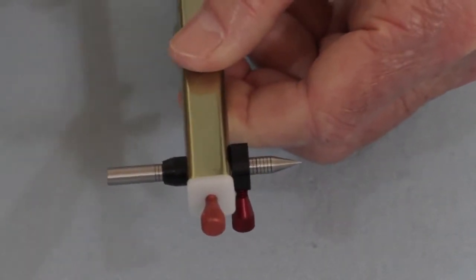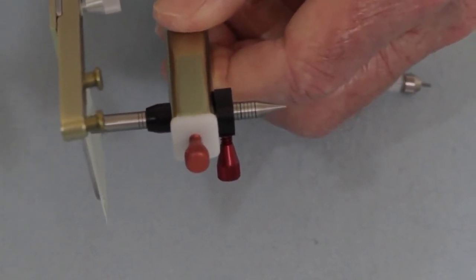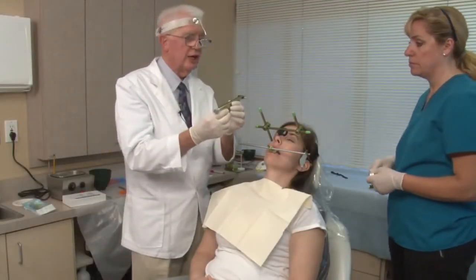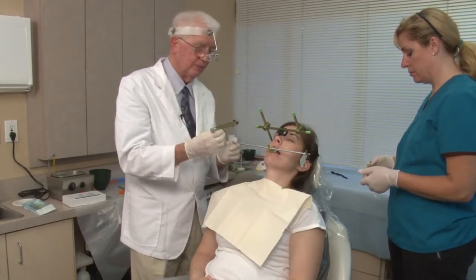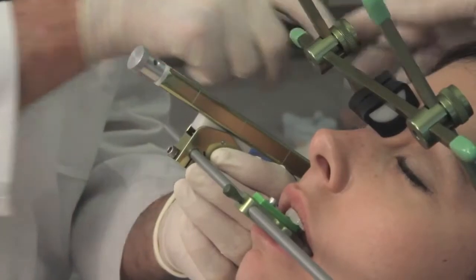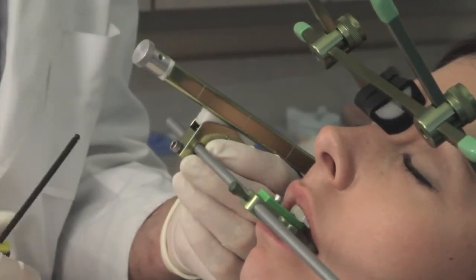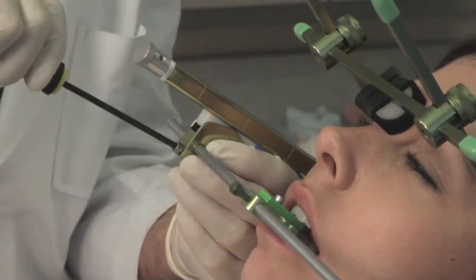and then you can see that when you have your sidearm on the crossbar and you move it in to touch the flag, that then sets the distance of the sidearm from the flag assembly, and now your writing pencil will work correctly. Then we'll move the sidearm in now until the dull part of the stylus pen touches the flag assembly. And the hinge axis is usually anywhere from 13, 14 millimeters in front of the tragus at about the middle to upper part of the tragus, so you can kind of approximate where it is and tighten your sidearm at that position.